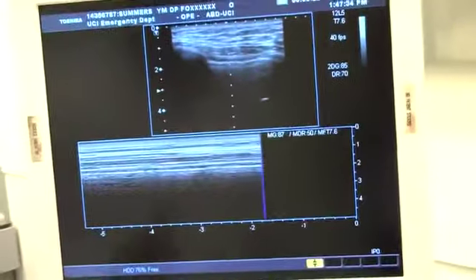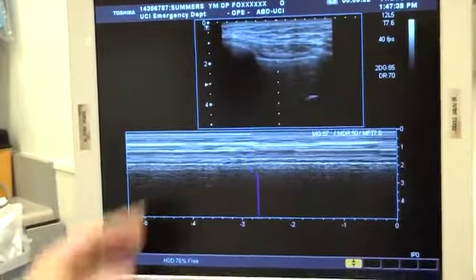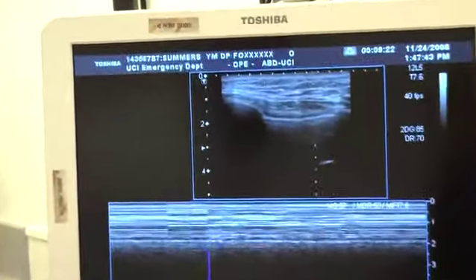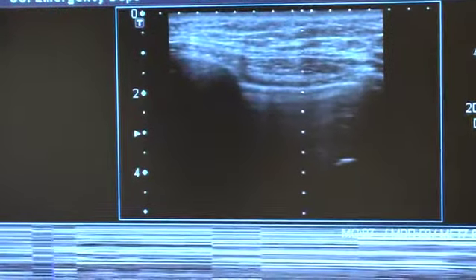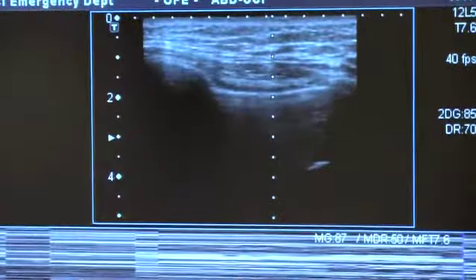So when I hit M mode, it's going to pull up this scan line, which I can move with the trackball back and forth. I'm going to take this scan line and put it right in between the ribs, going straight down, so it's cutting right through the pleural line.